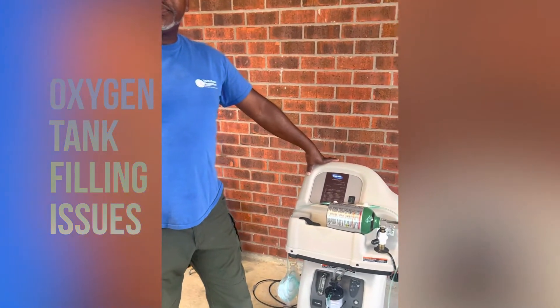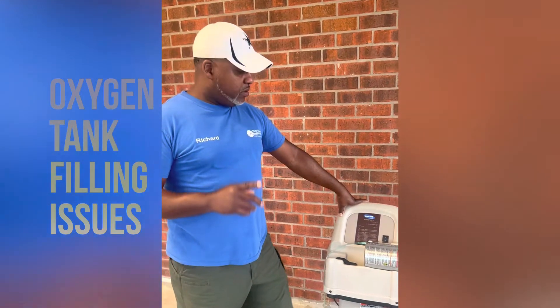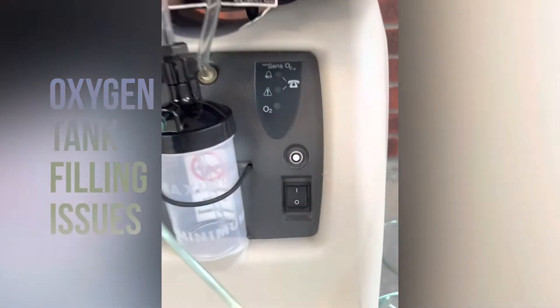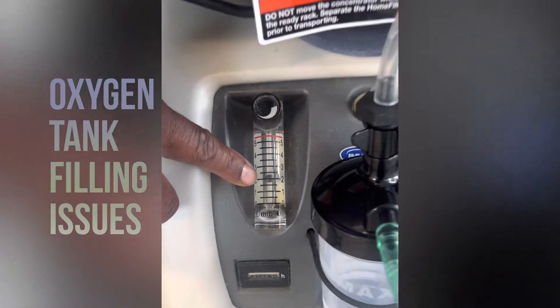Hey Mr. Rich, this is Mark. I'm having trouble filling up my oxygen tank with my home fill station. Can you please help me work through it? The first thing we want to know, Mr. Mark, is if you have your concentrator on. If your concentrator is on, the next thing is what's your liter flow on — the little ball.